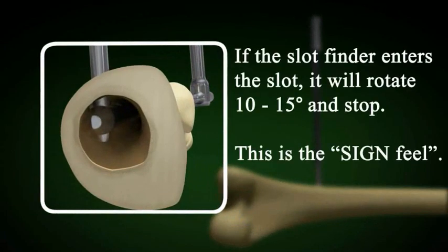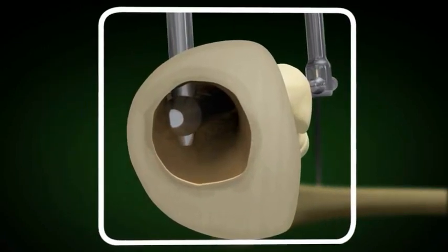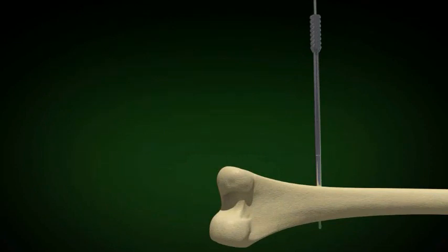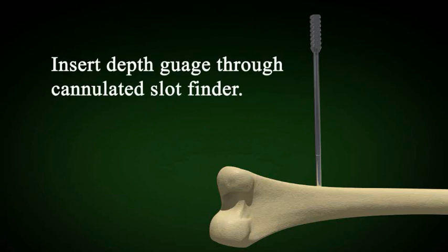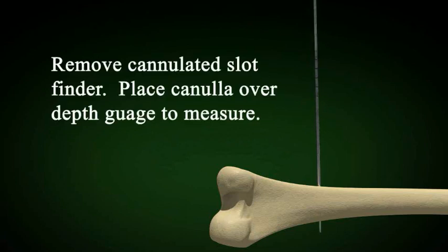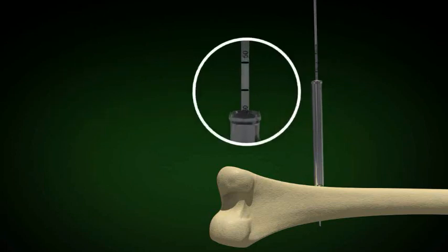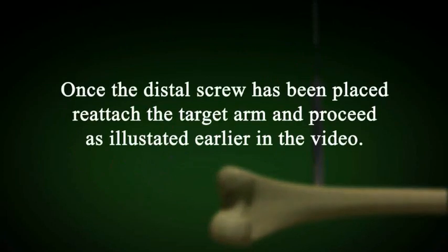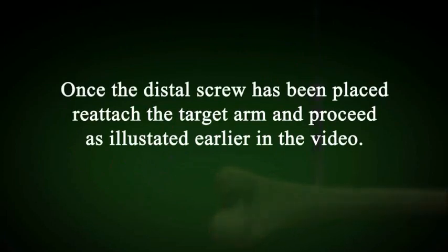If the solid slot finder is in the slot, it will rotate 10 to 15 degrees. This is the Sign feel and you've met the challenge of placing the distal interlock. Remove the solid slot finder and place the cannulated slot finder into the slot. Insert the depth gauge through the cannulated slot finder, then replace the cannulated slot finder with the cannula. Measure the depth of the screw using the cannula as noted before. Once the distal screw has been placed, reattach the target arm and proceed as illustrated earlier in the video.